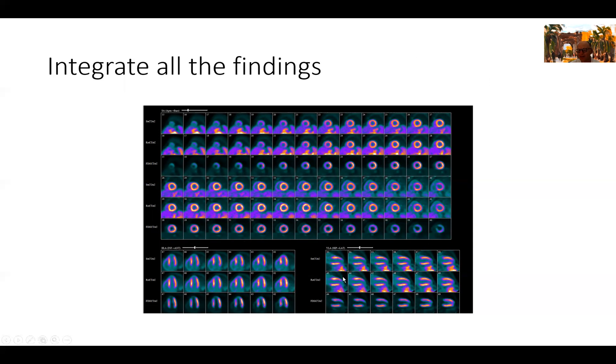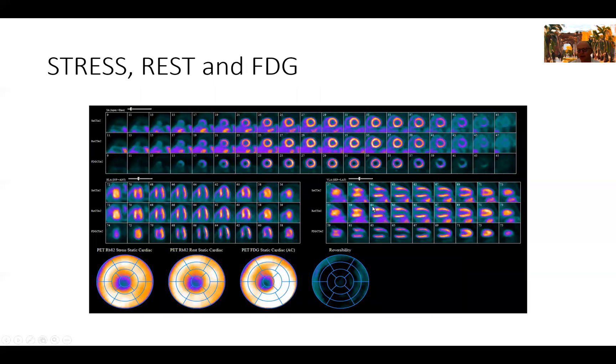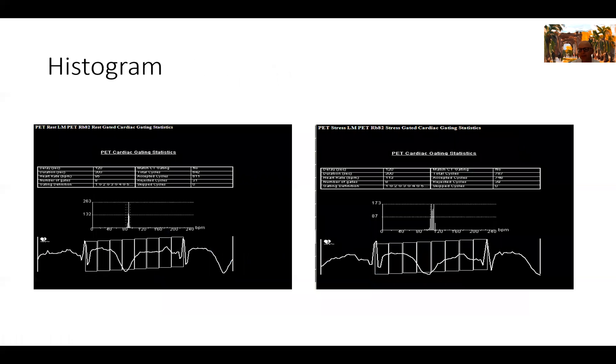Finally, before I go to report the case, I usually look at all the images combined. So we have the FDG on the bottom, rest in the middle, and the stress on top. And you can see this matched defect all across the three sets of images indicating scar in the LAD territory involving the apex. This is how it looks on the 17-segment model display, a perfectly matched defect. It's almost like a fingerprint of the heart. So we know that this is the same patient just from looking at where the defect is and the fact it doesn't change from rest to stress to FDG.